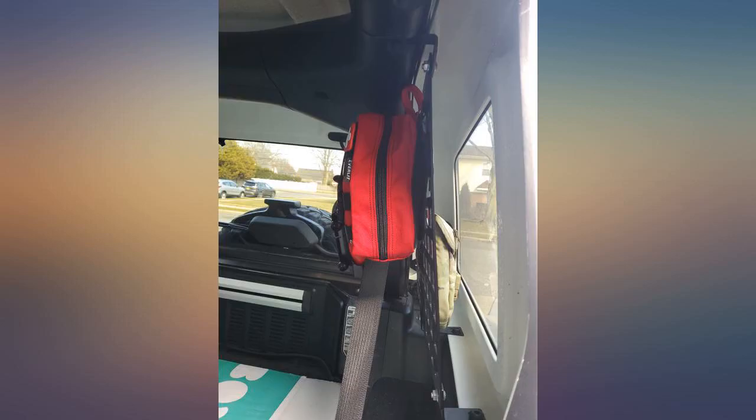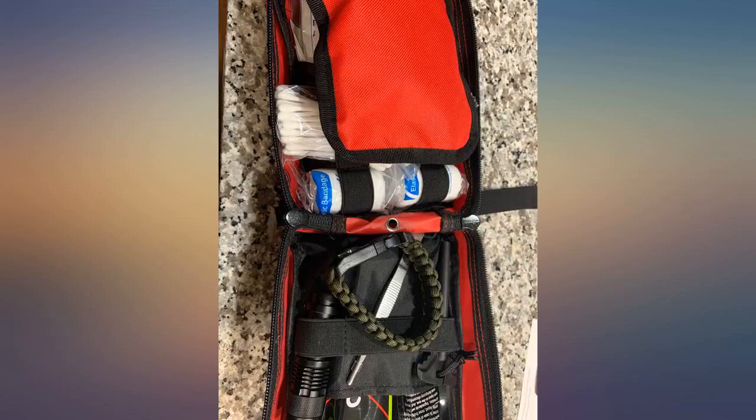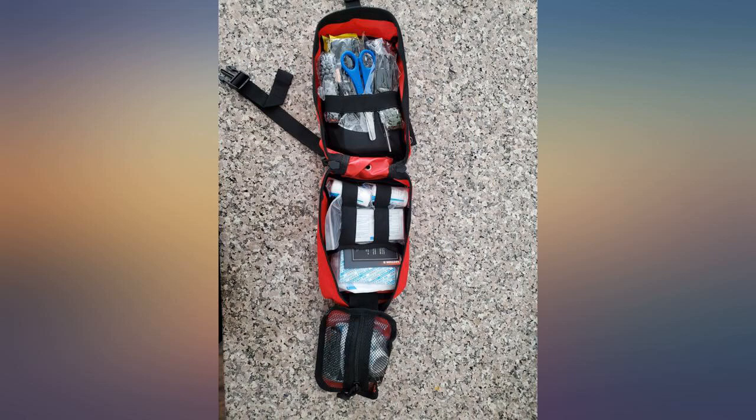I do a lot of camping and outdoor activities and this kit had a lot of items you don't know you need until you need them, and is still big enough to add a few more first aid items if you'd like. With as much as this kit comes with, I almost feel like it's a steal.